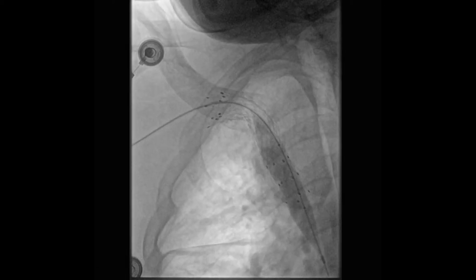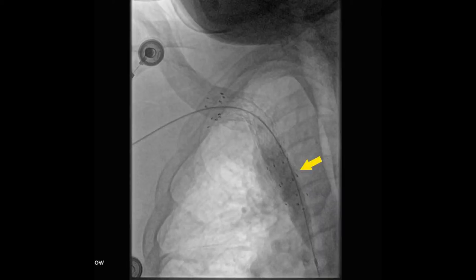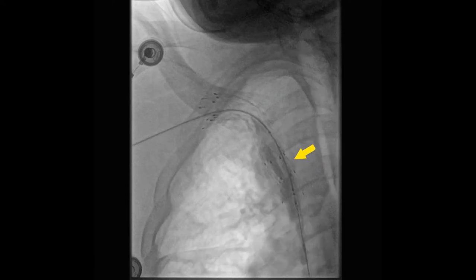The balloon was then positioned in the noted area of in-stent stenosis and inflated, as seen in this portion of the video.